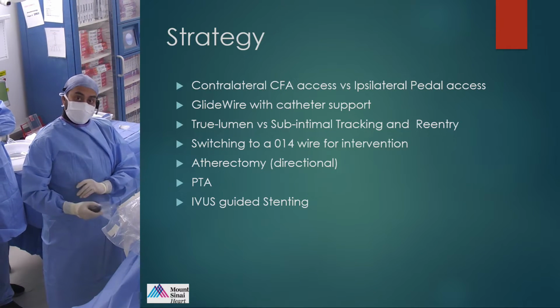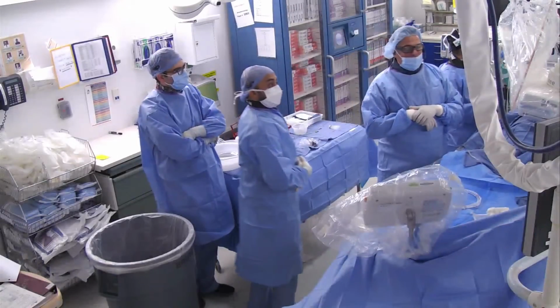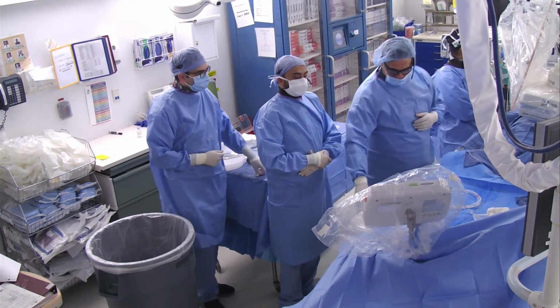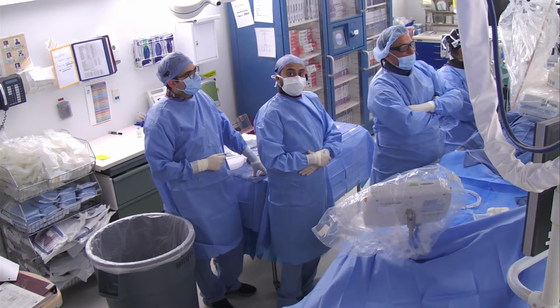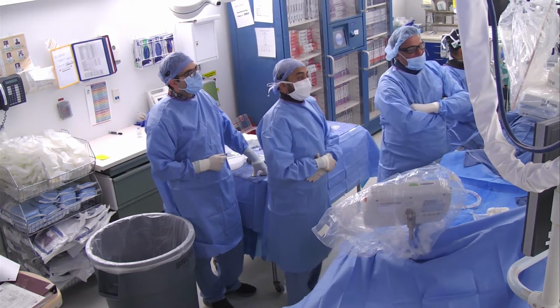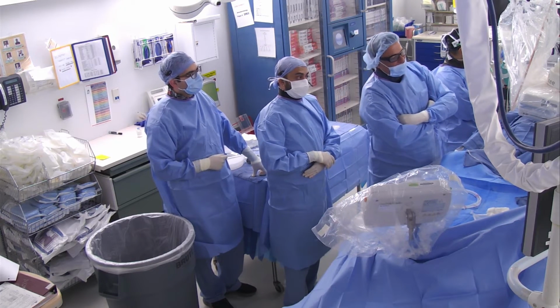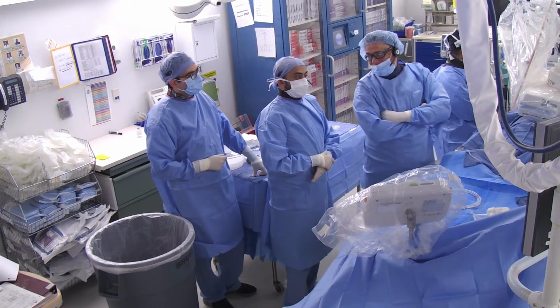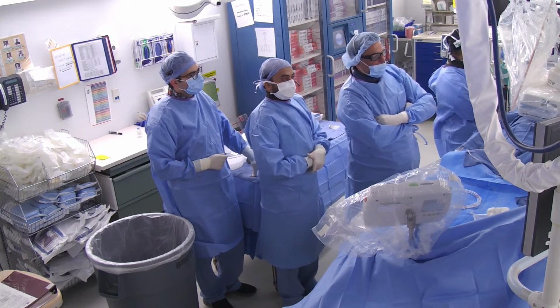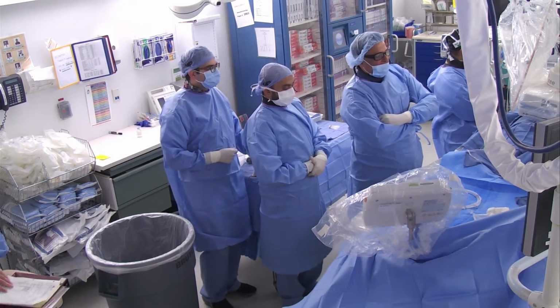So Ajit, I think we're going to stop there and just discuss here. Let me show you today's angiogram. As Haroon said, we've got a guy who's claudicant progressing to rest pain. Forget the right leg here, it's not really bothering him. He's had an intervention in the past, which showed some moderate SFA disease. There are increased velocities in the mid SFA above the stent, with a PSVR of 325. He has resting ABIs of 0.71 or something? Yes, 0.6, whatever it was. Not really critical ABIs in terms of rest pain, but he's a relatively young gentleman who's quite active and has a lot of symptoms in his foot.